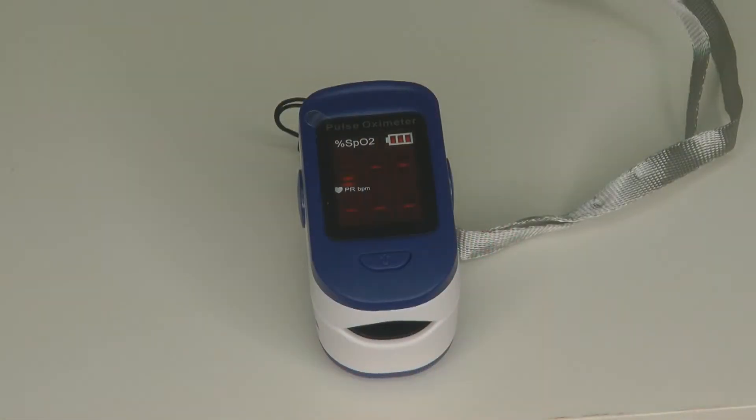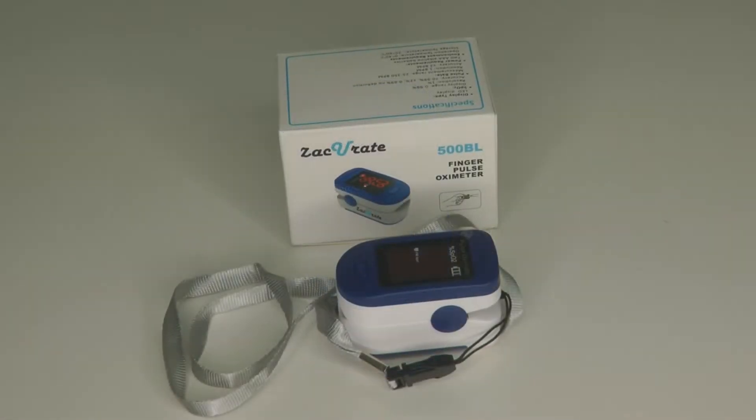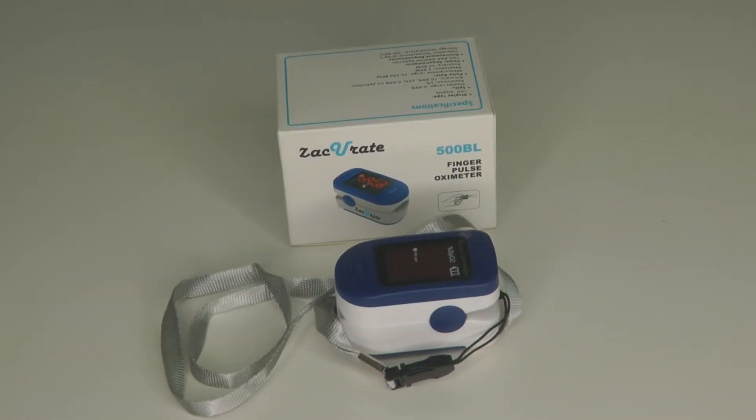Hi, it's AlaskaGranny. If you're into sports, aviation, or you want to monitor your health during cold, flu, or coronavirus season, a finger pulse oximeter might be something you want to add to your gear. What's a finger pulse oximeter?